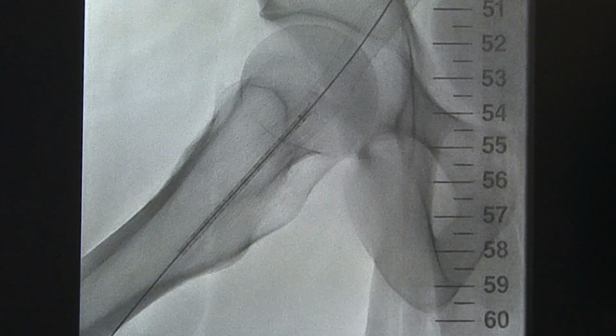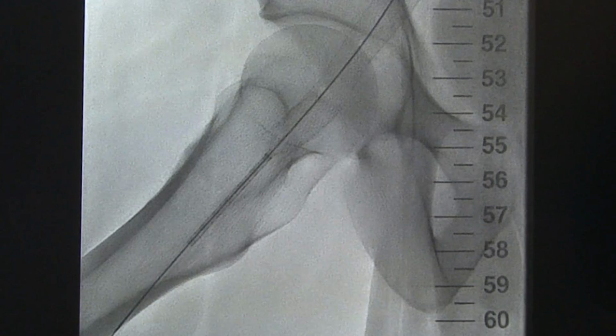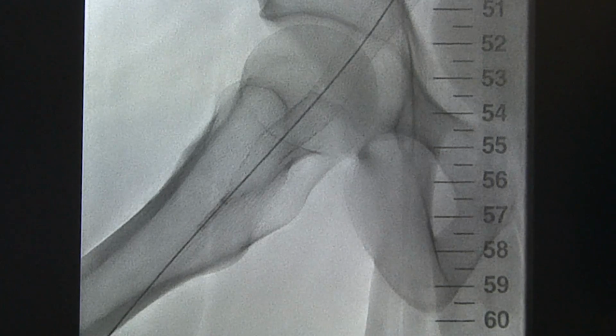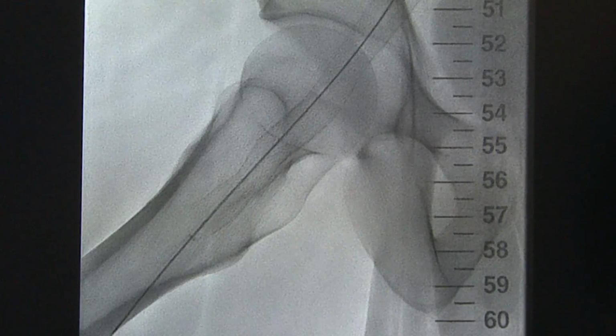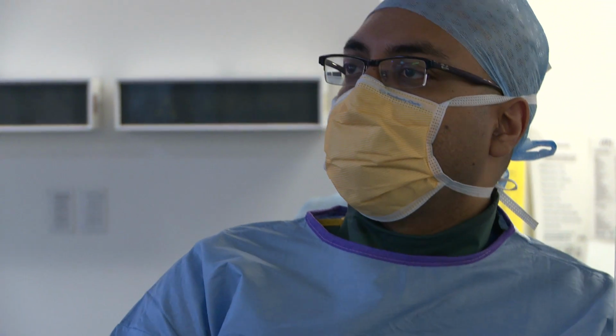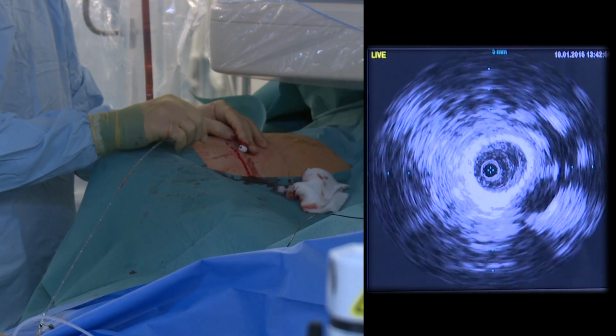Please note that the last stent can be overlapped as much as needed in order to get the proper peripheral landing zone. The third stent system is inserted for deployment. The stent will be positioned around the level of the 54 centimetre marker on the screen as previously determined. The peripheral end of the undeployed stent is well below the desired landing zone, but this is intentional. As the stent deploys, the peripheral end of the stent foreshortens. This is why an exact calculation of where to land the central end of the stent is made in advance.